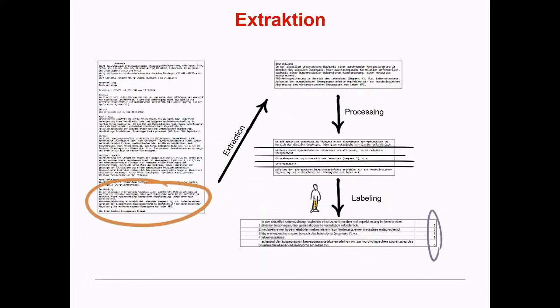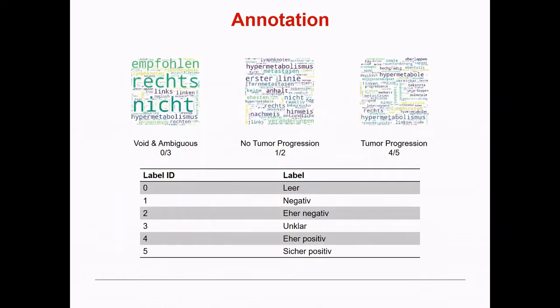And then you have labeled data, and you can start. This is actually an example of what that looks like. So you have this whole text. Here, this is the whole report. This is only the impression. We eliminate it, we cut it into sentences. And then we say, well, what does it mean? Does it mean tumor? Yes, no, maybe. And then we do that for about 200 cases, and we can start training an algorithm.